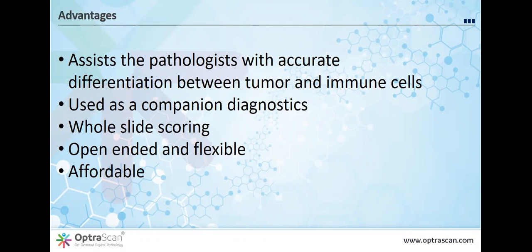So I don't see this, as Isha said, as replacing the pathologist. Where I have found it most useful is getting the algorithm performed on the IHC digital image before I ever look at the IHC stain. That way, the ones that are clearly positive, you know, greater than 50%, the algorithm never gets those wrong. The ones that are totally negative, it doesn't get those wrong either.